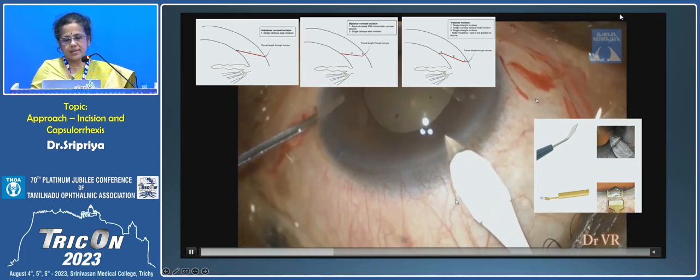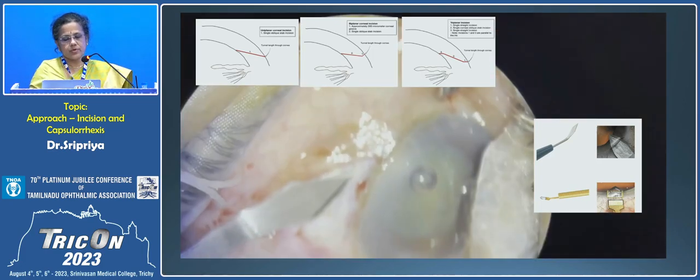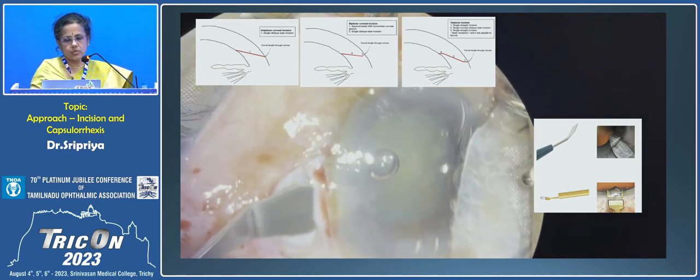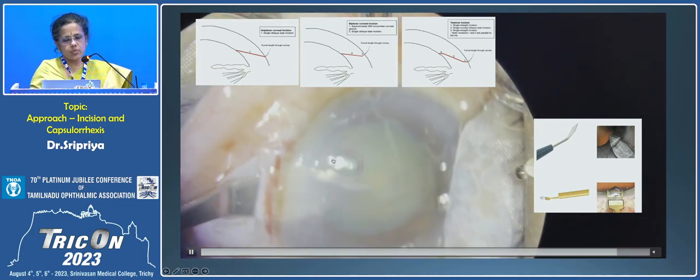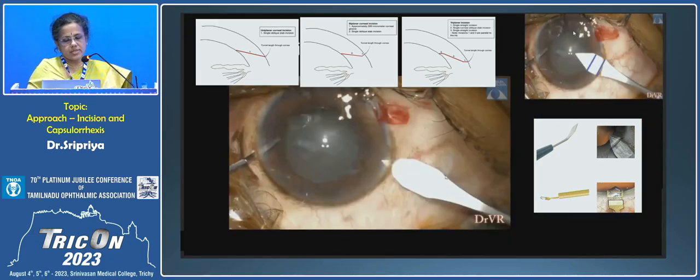Main thing is the intrastromal portion has to be at least 2 to 2.2 millimeters to give you a stable wound, and the entire fluidics that you talked about will go to a toss if your wound is leaking. In a triplanar wound, which is usually done in a sclerocorneal tunnel, the dip and then the horizontalization of the keratome will prevent a chevron forming there.